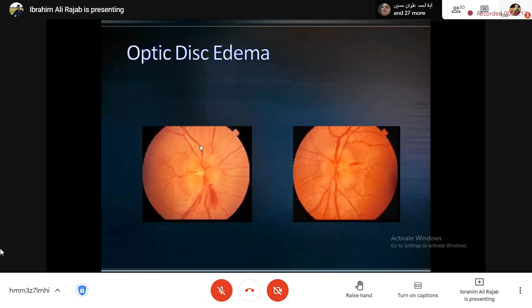Yes, you are right. You said that the optic disc is not well demarcated. You cannot tell where the margin of the optic disc is. فإحنا ما نعرف بالضبط حدود الأوبتيك ديسك وين. It is not well demarcated.